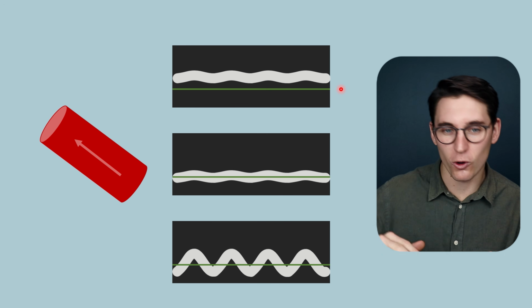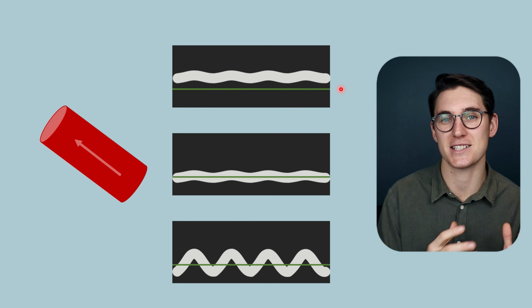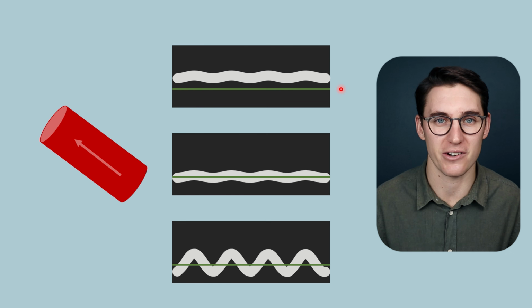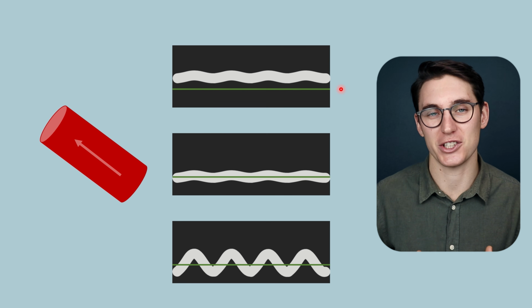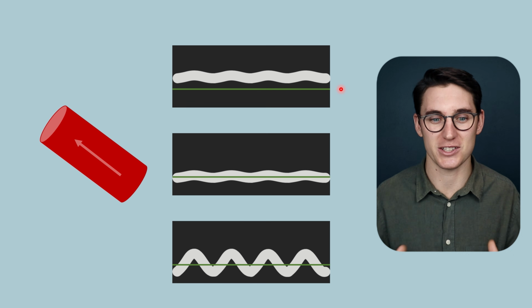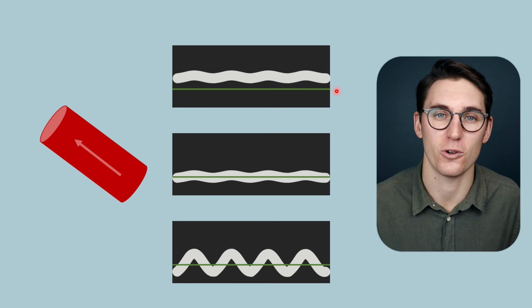Now that waveform has a slight phase to it, and that phase is dependent on both the cardiac cycle as well as our respiratory rate. As we breathe in and out, we are changing intrathoracic pressures, and that also changes our venous pressures. So we can see the slight phase to the waveform.